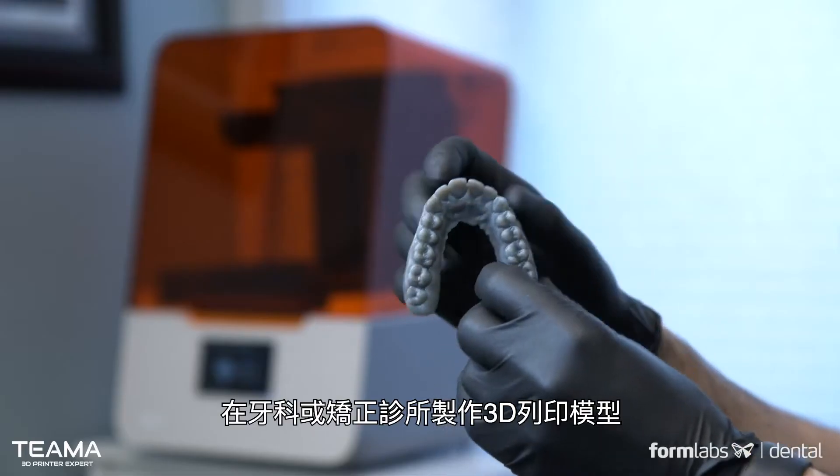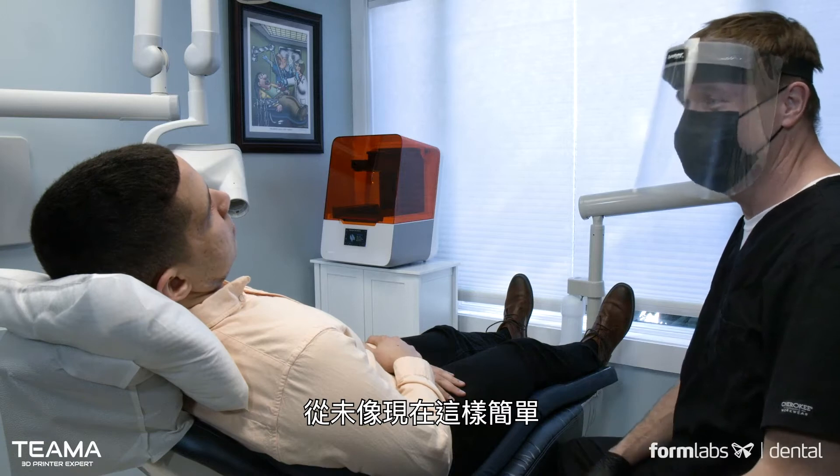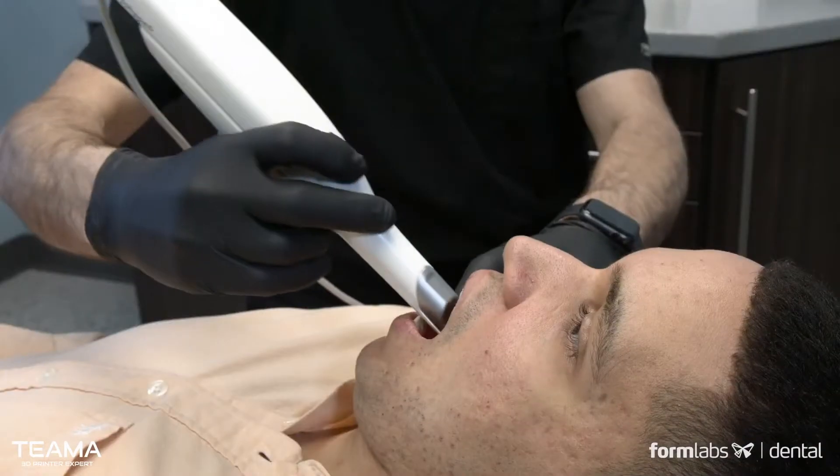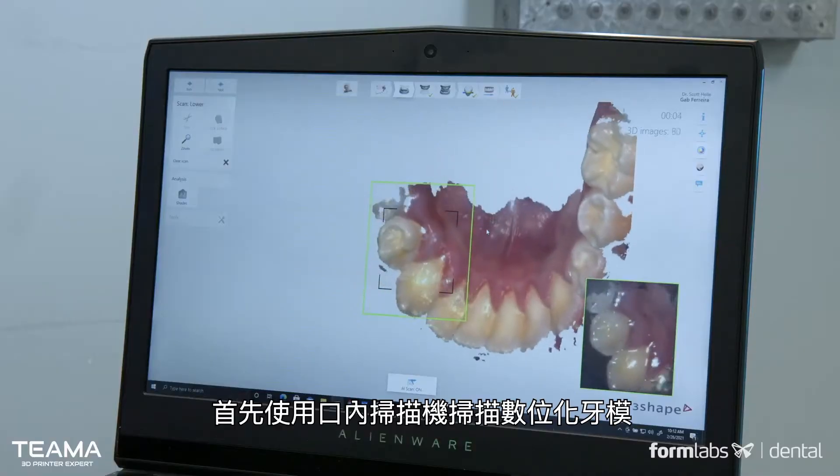It's easier than ever to make 3D printed models in a dental or orthodontic office. Here's how it works. First, take a digital impression with an intraoral scanner.